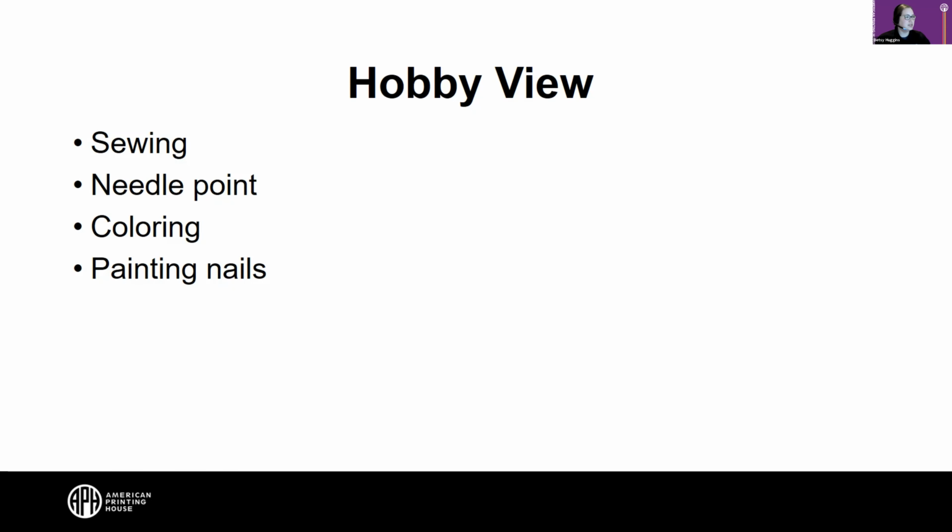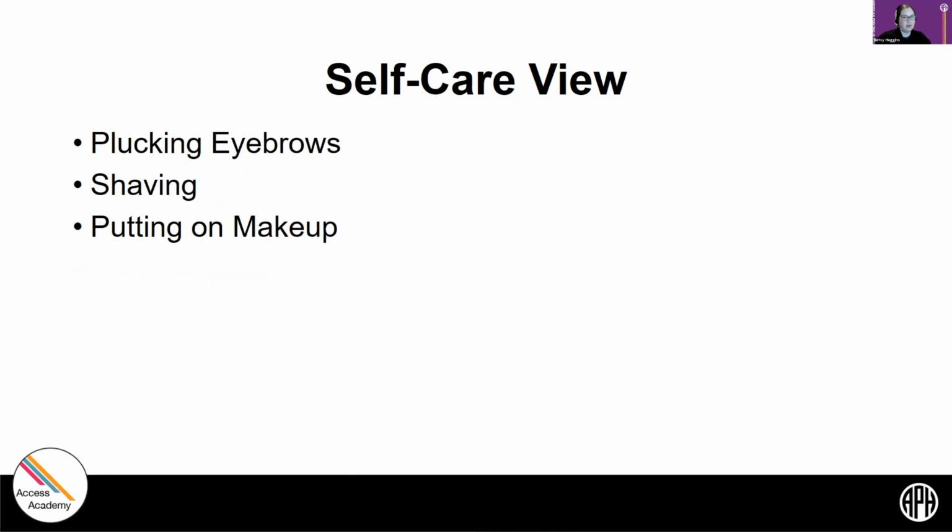Awesome. And people are really excited to learn more about self-care view. So let's get to the next slide and talk about some self-care tasks that can be accomplished with the Juno. Yeah, so you can rotate that camera all the way towards you, so you can see your face on the Juno's screen, and you can zoom in and out and be able to see your face clearly.